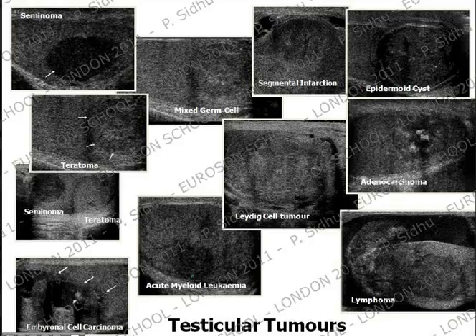But when you're looking with ultrasound, there can be a whole range of appearances of these tumours, and you need to be able to tell which is the abnormal, which is the malignant lesion, as in this patient, from this patient, which is not a malignant lesion, and this one, which is not a malignant lesion, because very often the surgeons, the urologists say, well, you've got two, we'll take one out, it doesn't matter. Well, we want to avoid that if you've got benign disease.